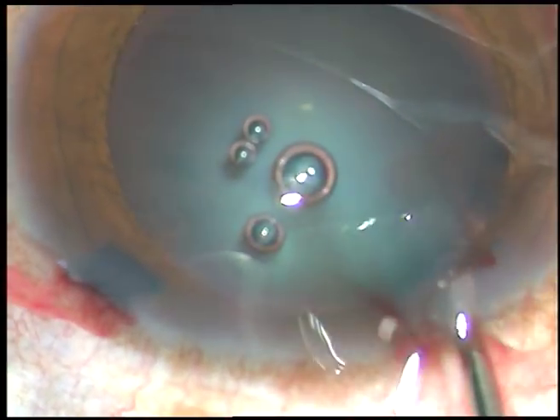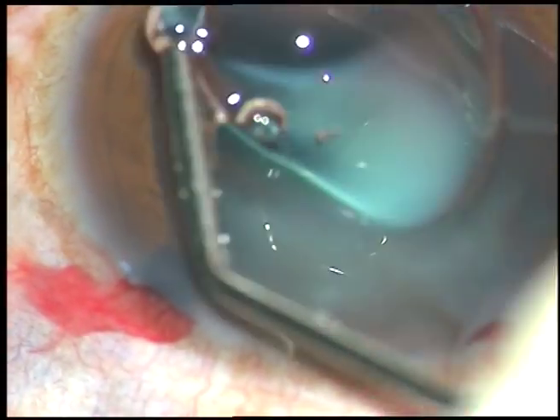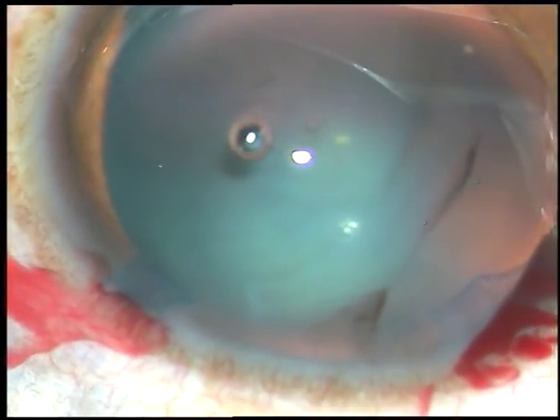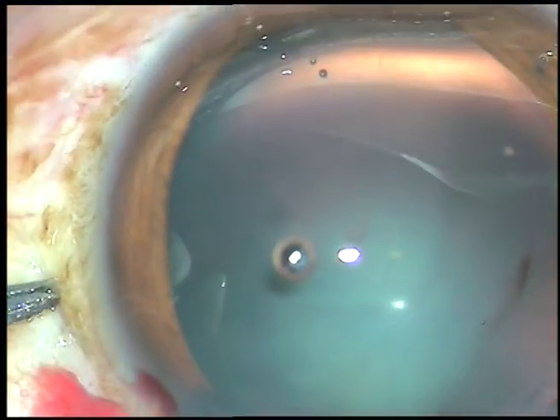Here goes the viscoelastic substance. The viscoelastic substance has been sprayed over the corneal epithelium to protect the epithelium as well as for better visualization.